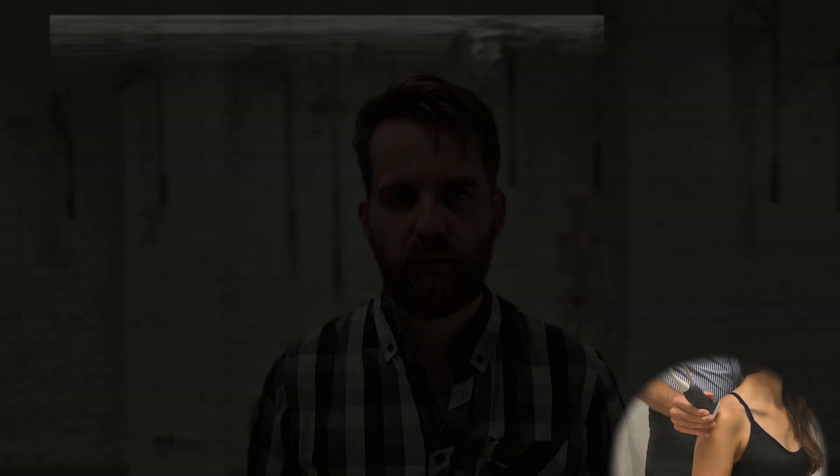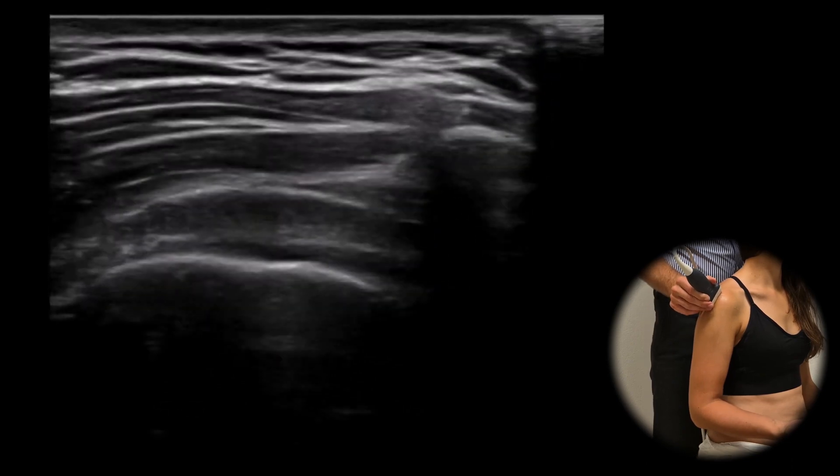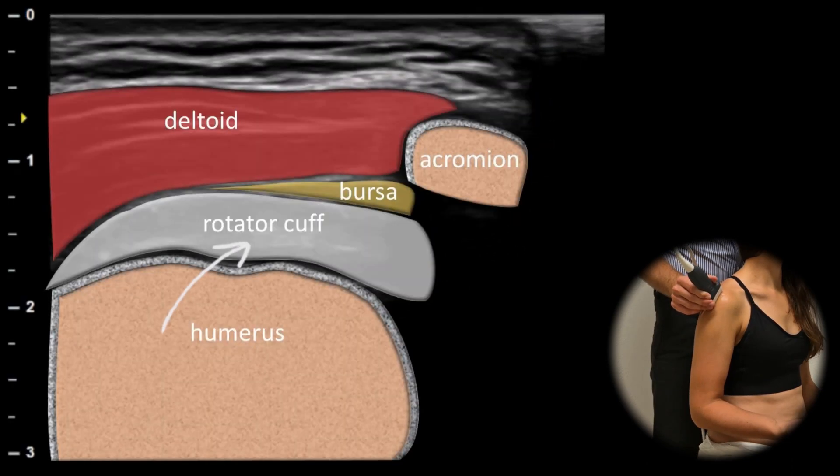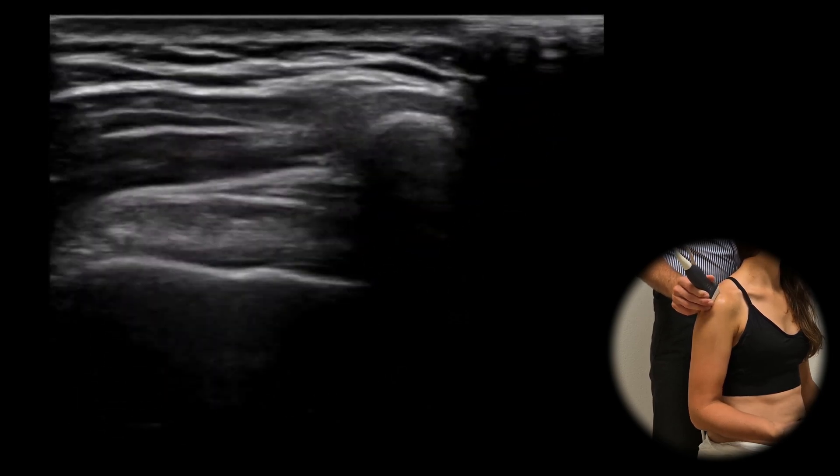Physiological finding: In a healthy shoulder, the subacromial subdeltoid bursa is located between the rotator cuff and the deltoid muscle. Normal bursa usually appears as a thin line without noticeable bulging and should measure less than 2 mm in thickness.